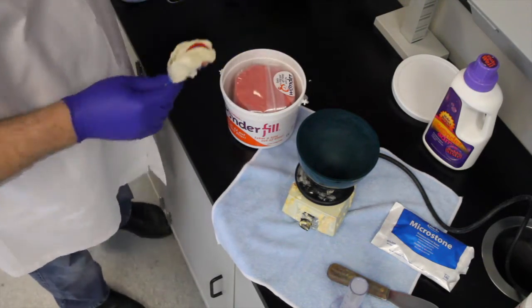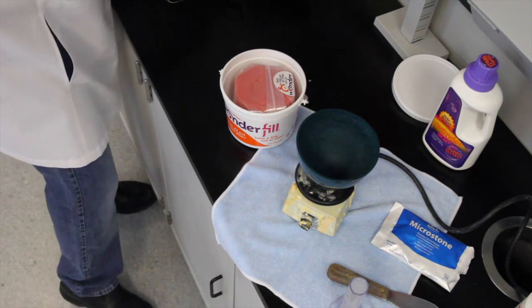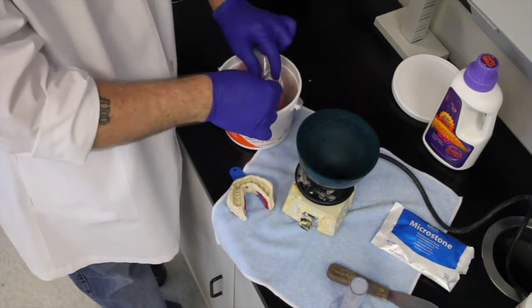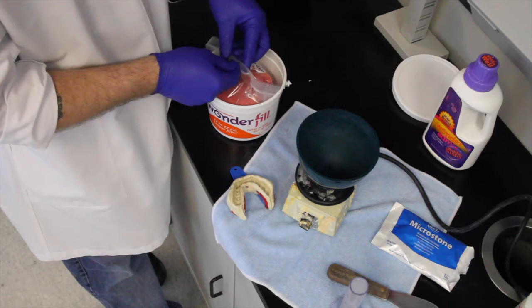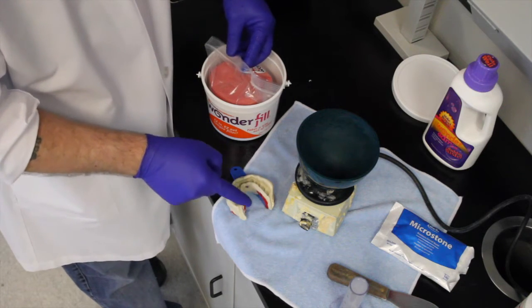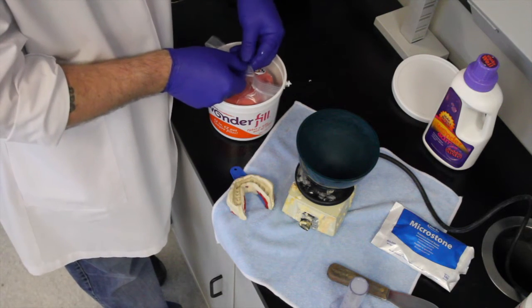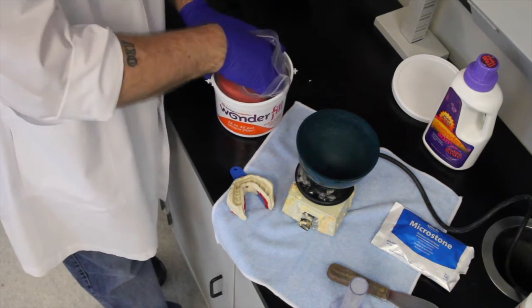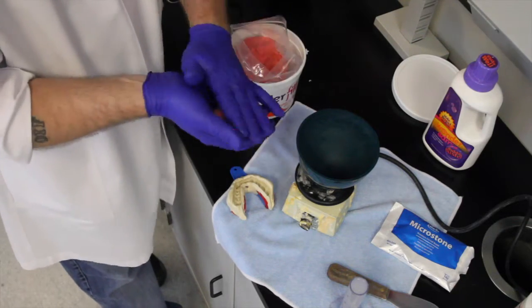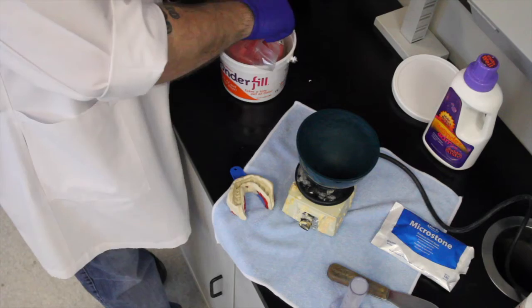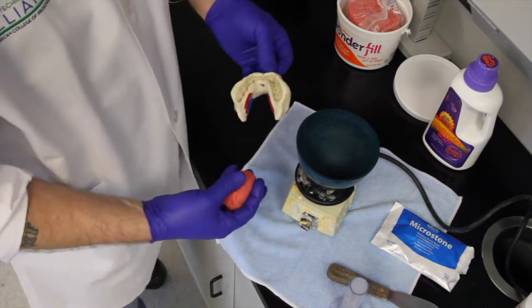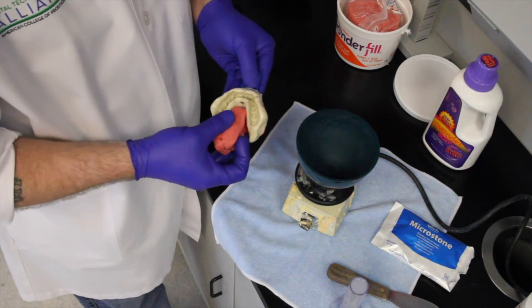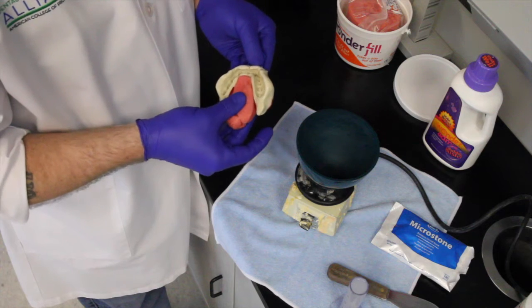Take your model and rinse the Cabicide off. Shake off the excess water. Open your Wonderfill. We're just going to be filling this tongue space in right here. So we're not going to need a lot. This product is reusable. So I actually have a container of brand new and another container of used. Get yourself a nice little golf ball size of Wonderfill. Adapt that into the impression without distorting the impression itself.